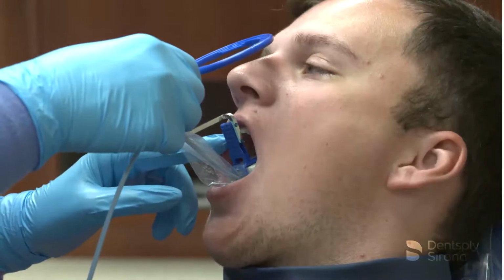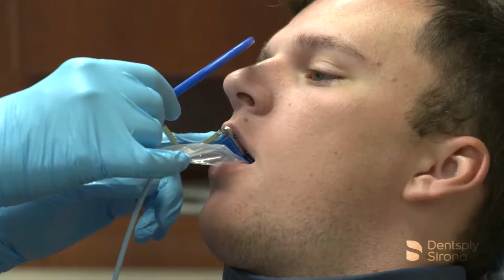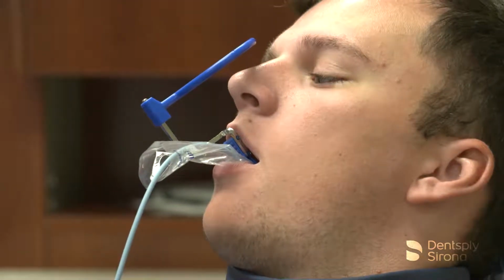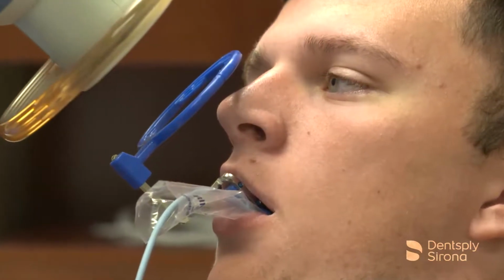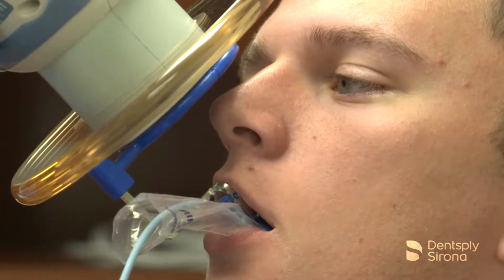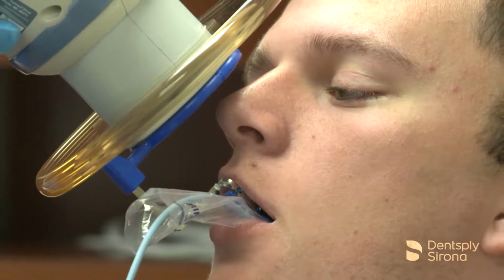To capture maxillary images using the XCP Short Arm aiming device, center the bite block behind the maxillary anterior teeth being captured and rest the bite block on the incisal edges. Instruct the patient to close slowly and align the handheld portable X-ray device to the aiming ring. The image is now ready to be captured.